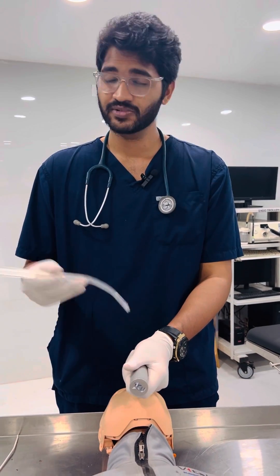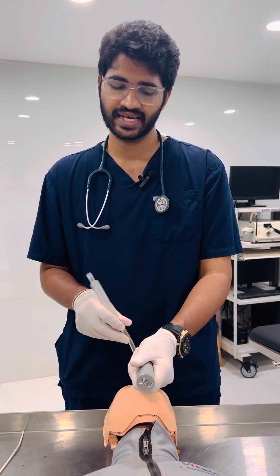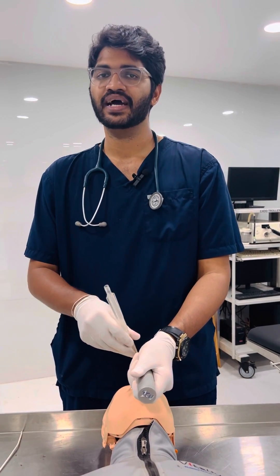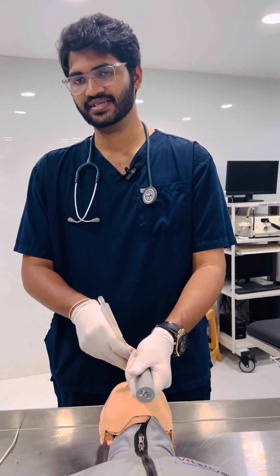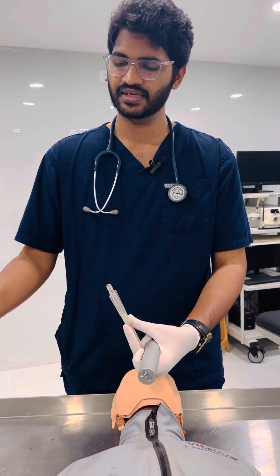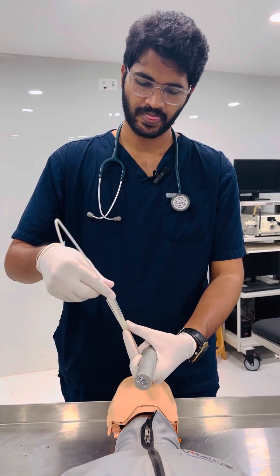Before inserting the catheter, first perform suction of the hypopharynx and larynx. Then insert the suction catheter into the vocal cords, fix the catheter and hold it steadily, and then place the bougie into the suction catheter.